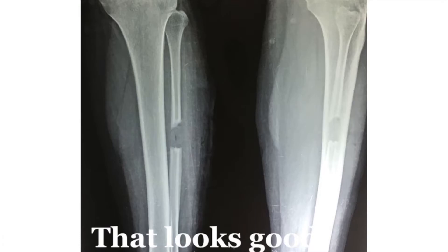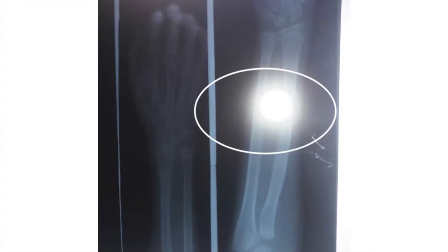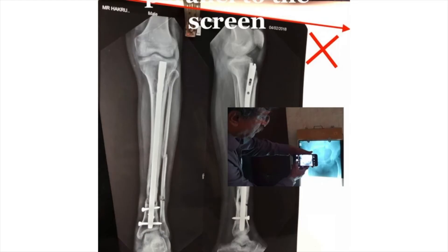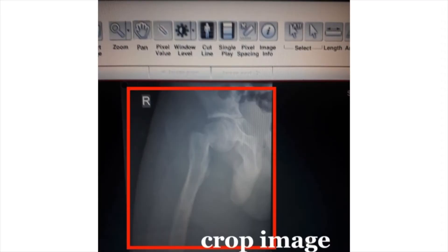The lessons we learn here are: switch off the flash and keep the camera steady. Switch off the flash. Keep the camera parallel to the screen so that we are able to get a square crop with the precise area we need for posting on the internet or sharing with our friends. Just crop the image, take away all the unnecessary areas around, and ensure that the hospital name, patient's name, and all other identification is cleared away from the frame.